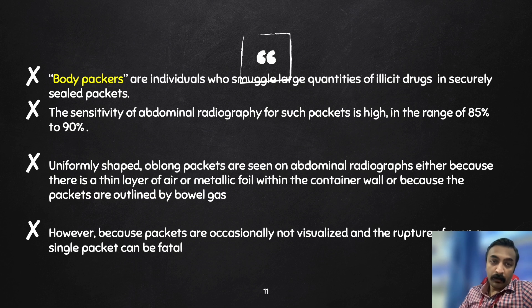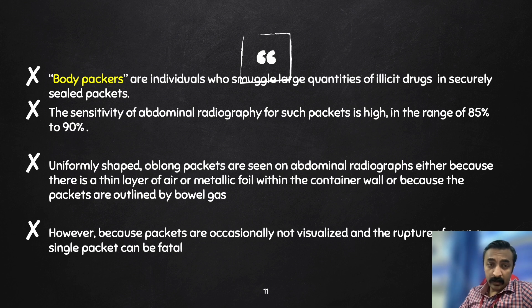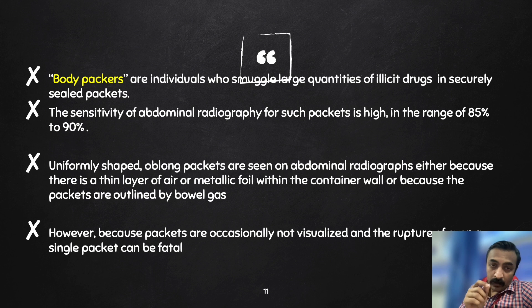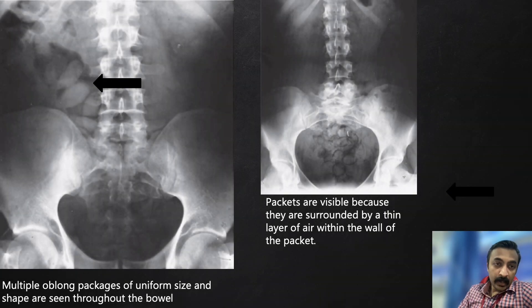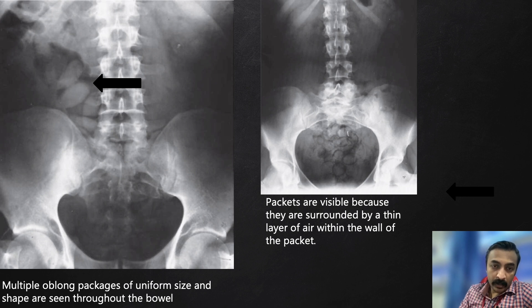This is a CT image of a body packer. Body packers are individuals who smuggle large quantities of illicit drugs in secured sealed packets. The sensitivity of abdominal radiograph for such packets is high, ranging from 85 to 90%. Uniformly shaped oblong packets are seen on abdominal radiographs either because there is a thin layer of air or metallic foil within the container wall, or because the packets are outlined by bowel gas. Remember that rupture of such a pack would be fatal to the carrier.